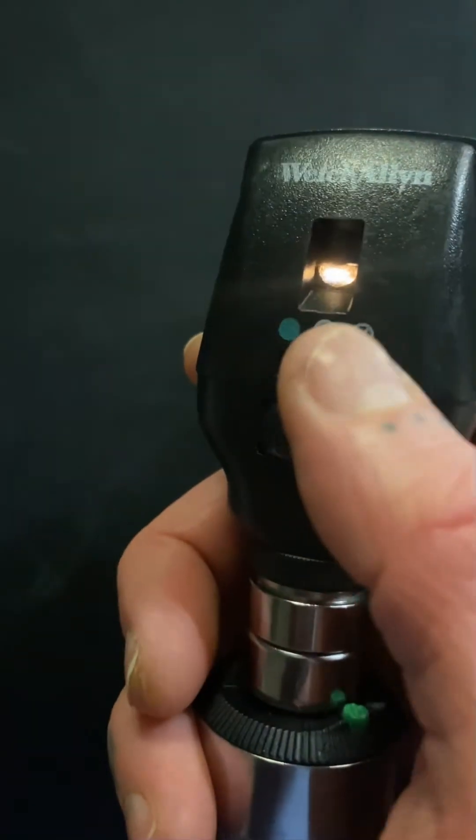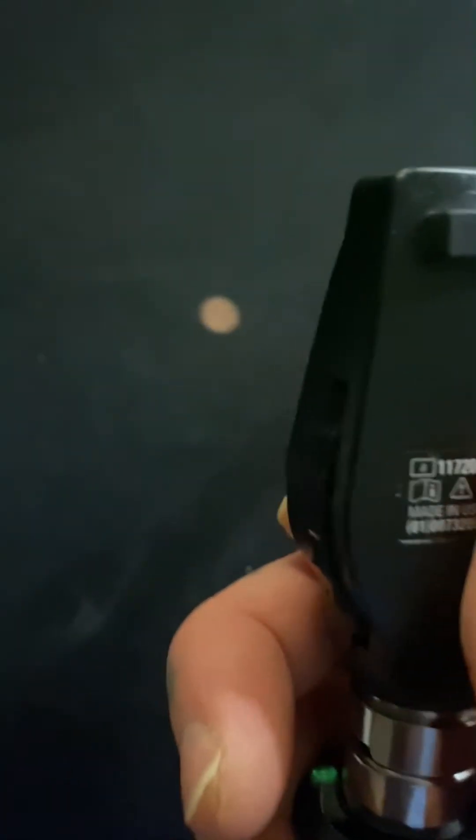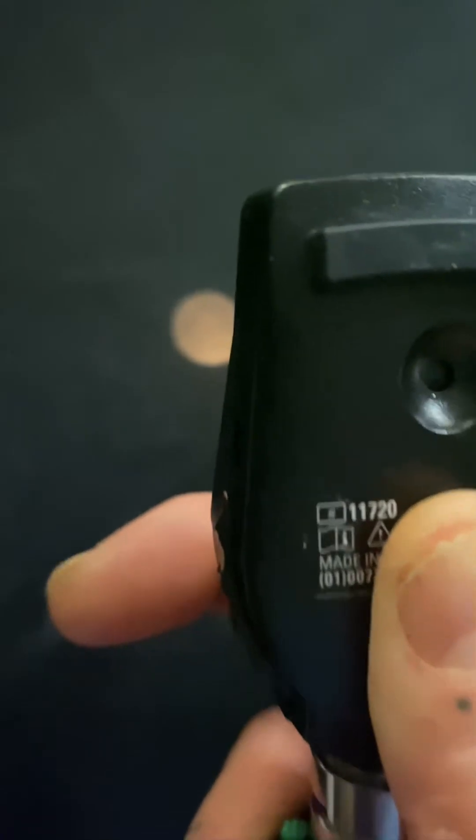Going back to the other side, I'm going to use the filter switch, which gives me different window sizes and color. This one has a grid, and then that goes to the largest setting, medium, and small.